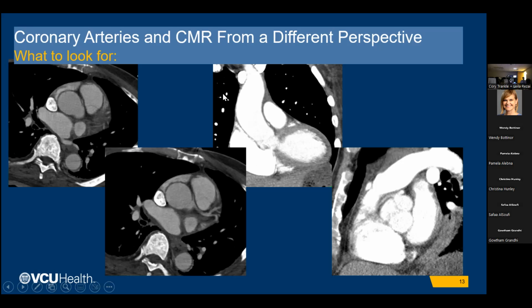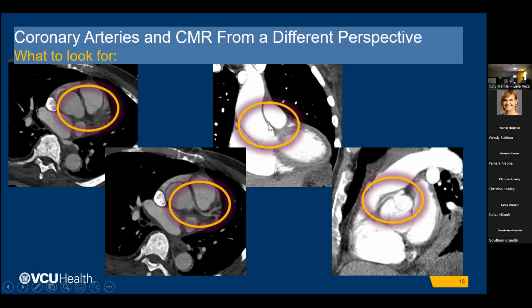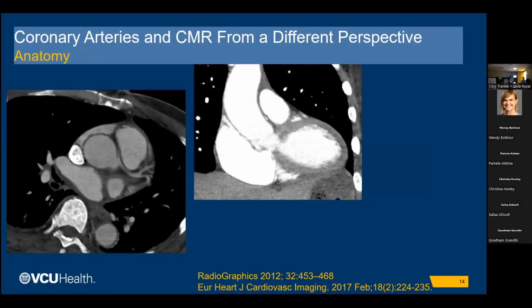In comparison to that, we have the interarterial course when we have a common coronary artery from a left-sided cusp, and then the right moves between the two arteries, appears to be intramural, and it's slit-like and narrow. And this would potentially be a malignant course.